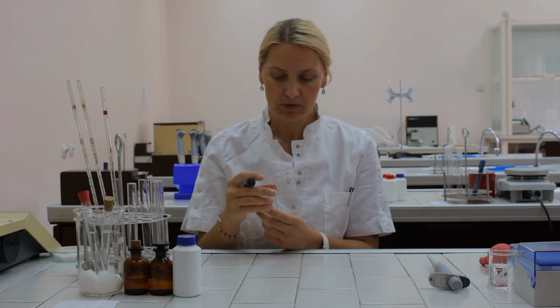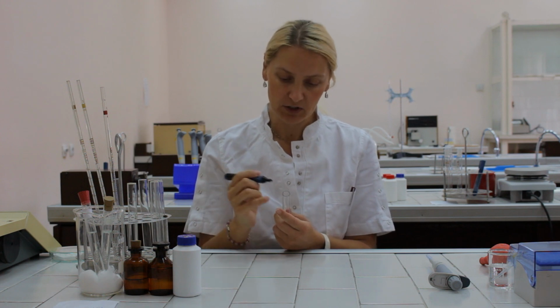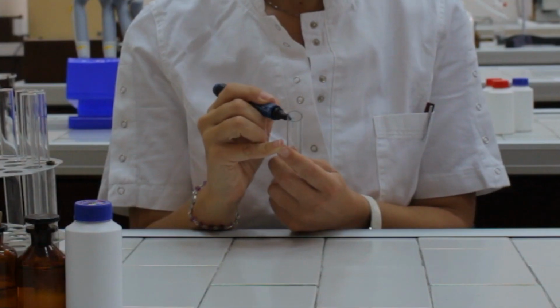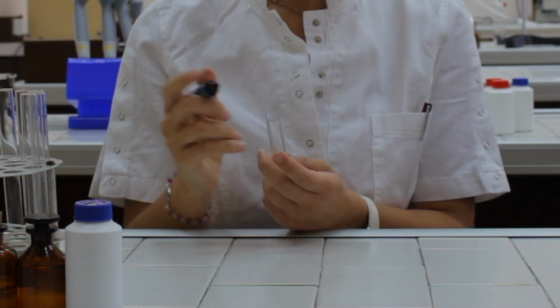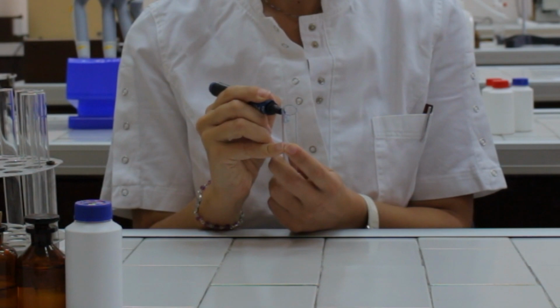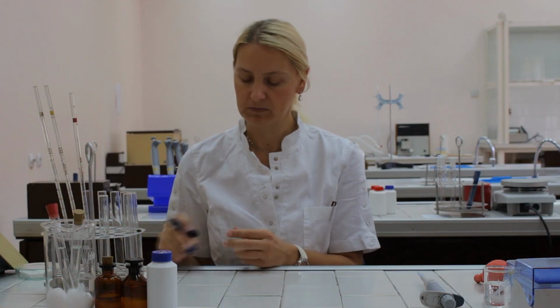Then a test tube in which the unknown solution of inorganic phosphate is going to be placed. For example, mark it with T as test. And the last one for adjusting the zero of the photometer or for the blank solution.